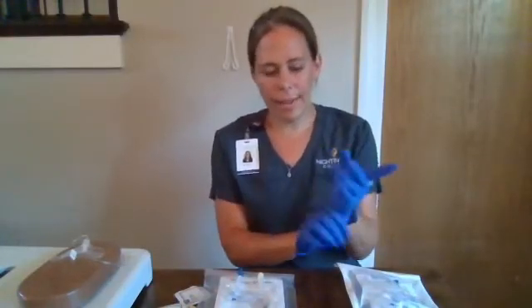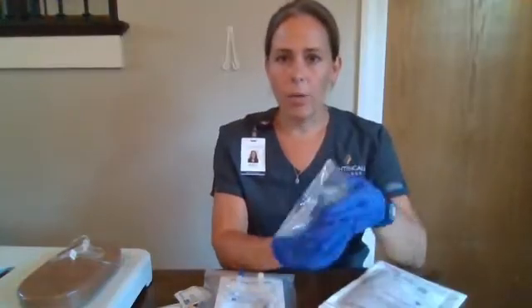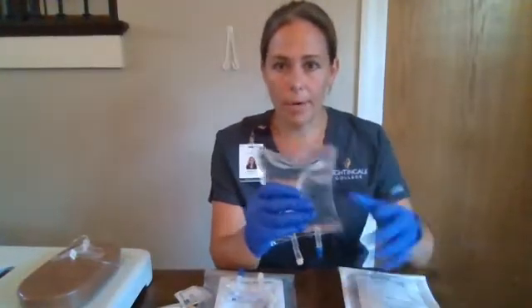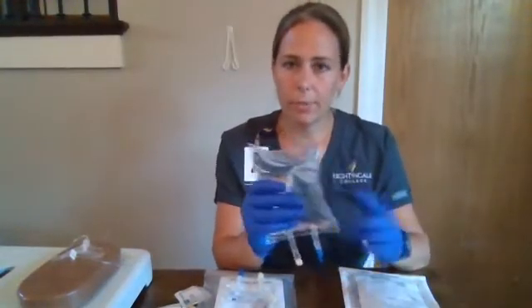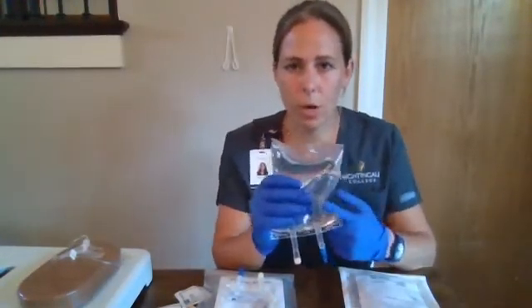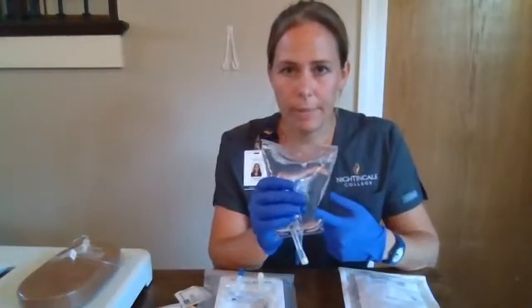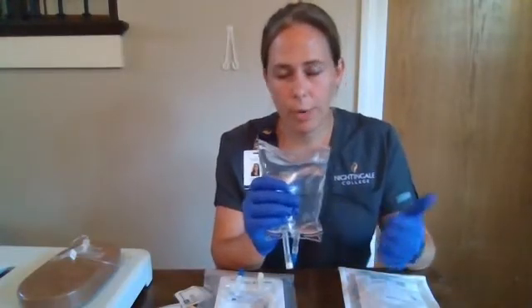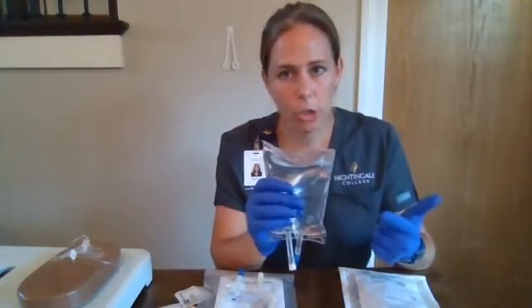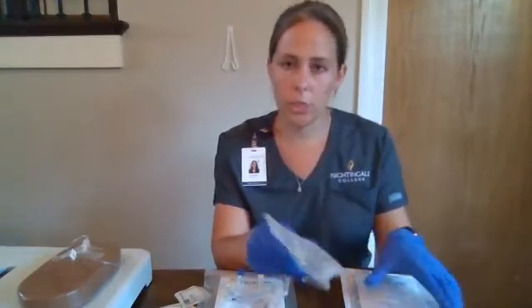All right, we have gathered our supplies. We have our primary fluid. We verified our physician's order in the MAR, verified the six rights of medication administration: we have the right patient, drug, dose, route, time, and documentation.